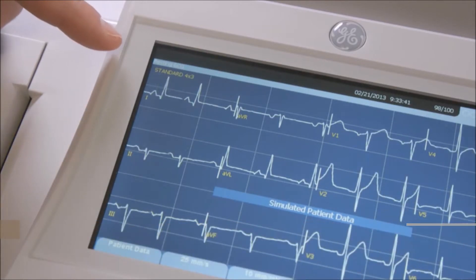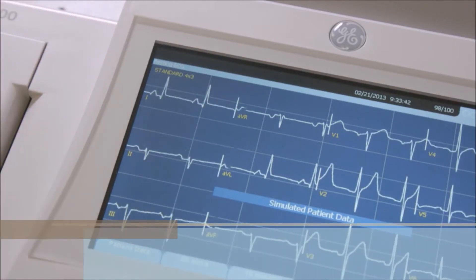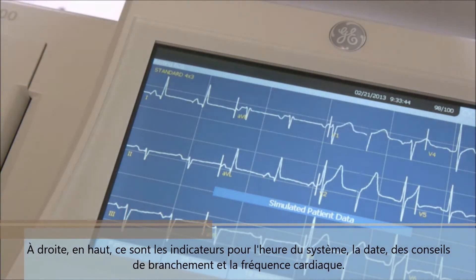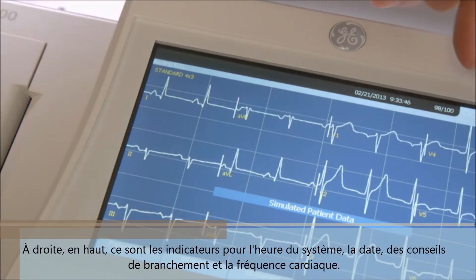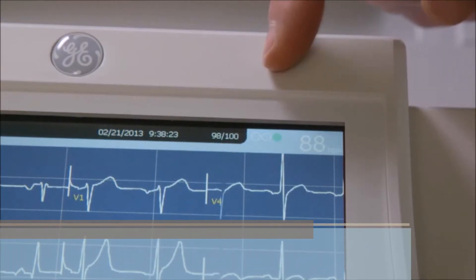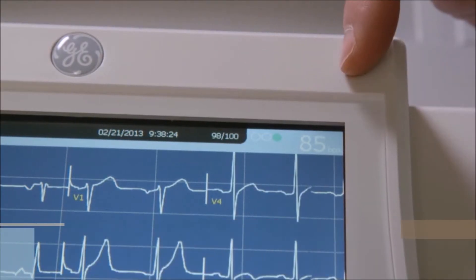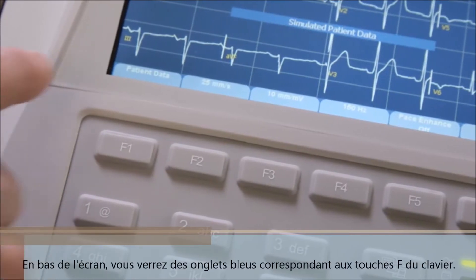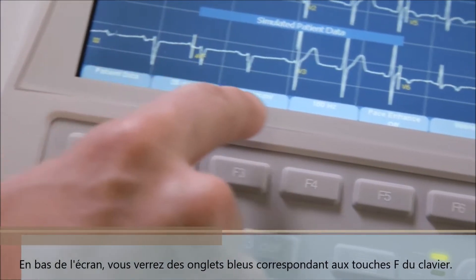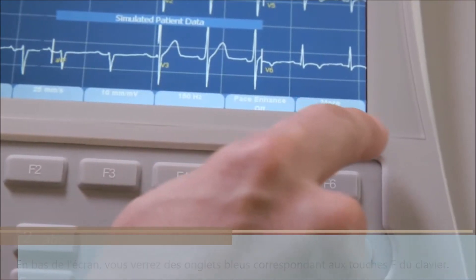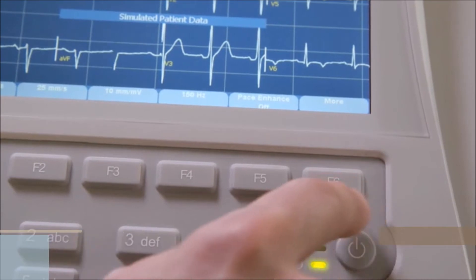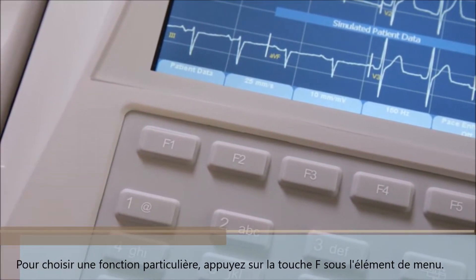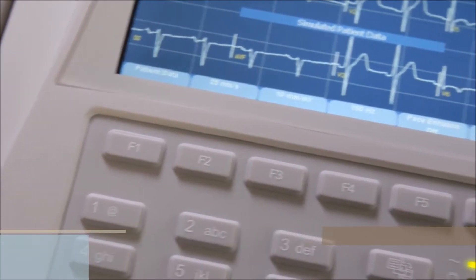The lead labels identify the corresponding waveform and its quality. Display format and operating mode are displayed in the upper left corner. To the right on top are indicators for system time, date, and hookup advisor and heart rate on the far right. Across the bottom of the screen, you will see blue tags that correspond to the F keys on the QWERTY keypad. To choose a particular function, press the F key beneath the menu item.